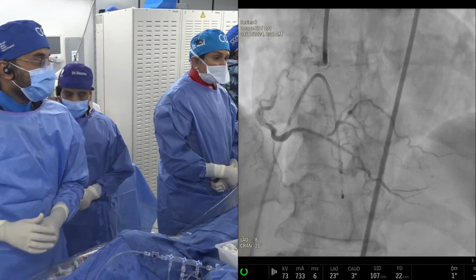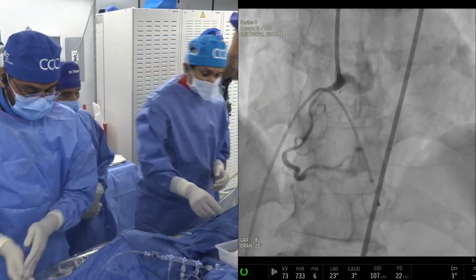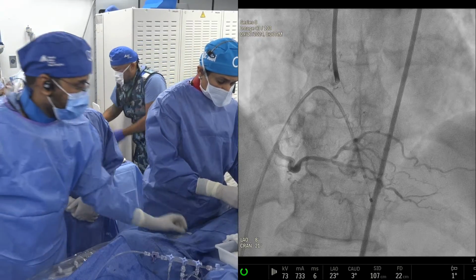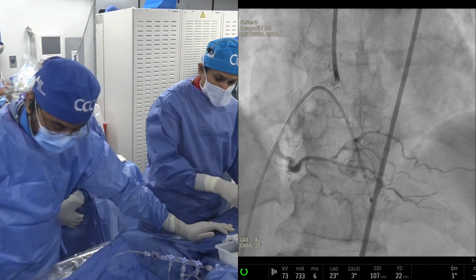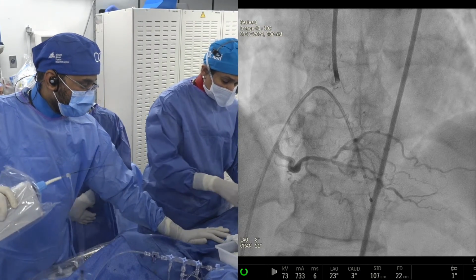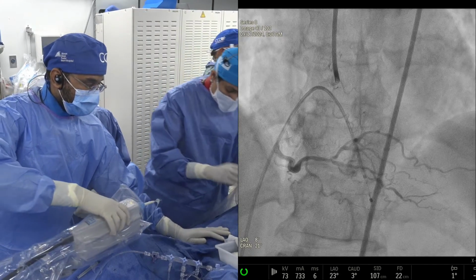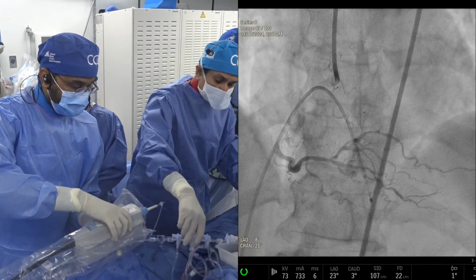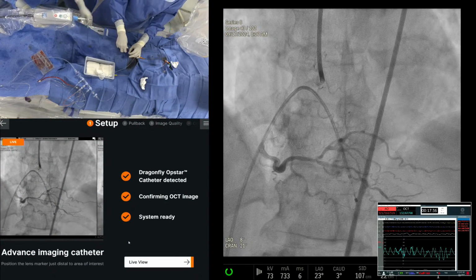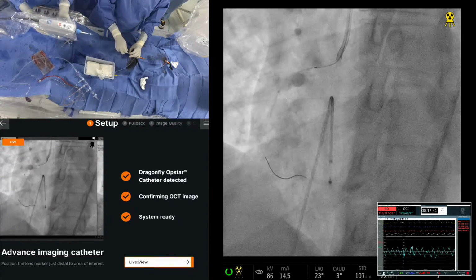The question was IVUS versus OCT. Since we'll be talking about both of them, the consensus was let's do the OCT. Overall, imaging is being done in about 30+% in our ACC and CDR, with 75-80% still IVUS and OCT about 20%. In many countries, like India, more OCT is done than IVUS. But overall, even in the Renovate Complex PCI trial, 75% was IVUS and 25% was OCT. So we are actually about 90-10.